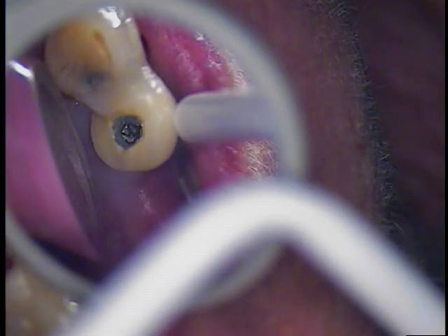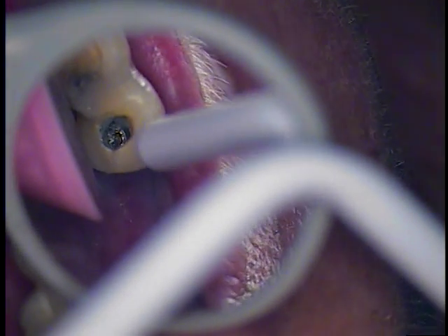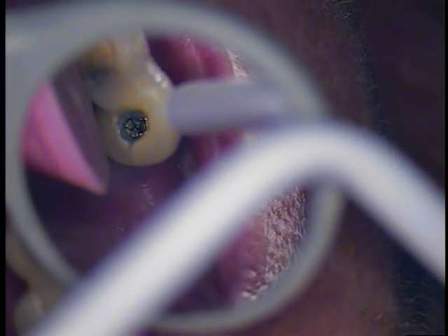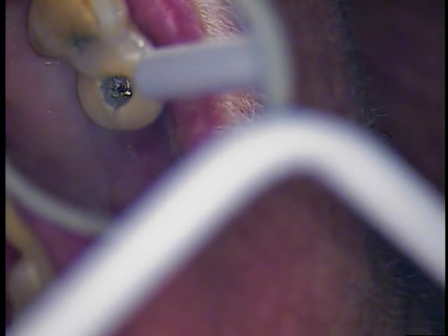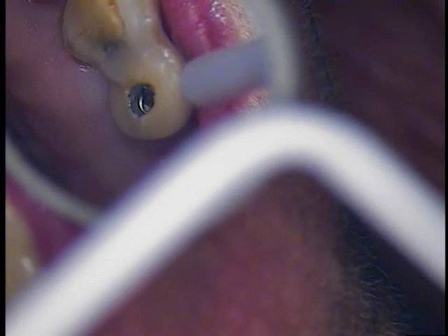It's already letting in more light so we get a good idea of the top of that screw. Supposedly it was an internal hex screw that got stripped. Now we're going to prep a little bit more lingually — I'm going to switch burs and bring in a little tapered diamond, a coarse diamond on the lingual.